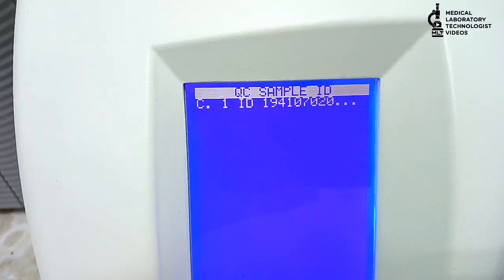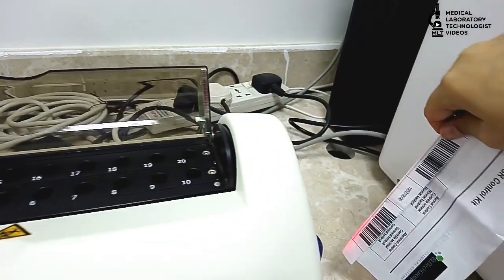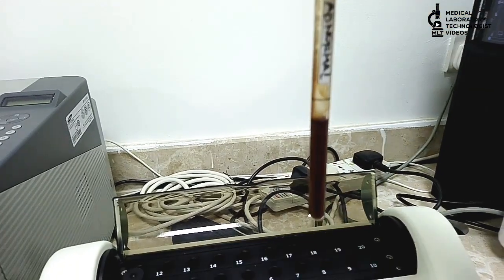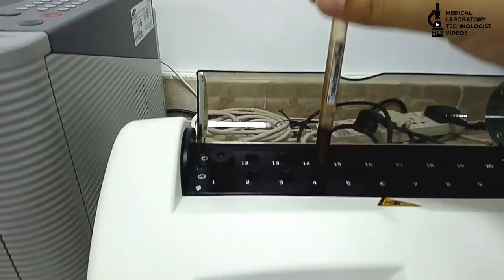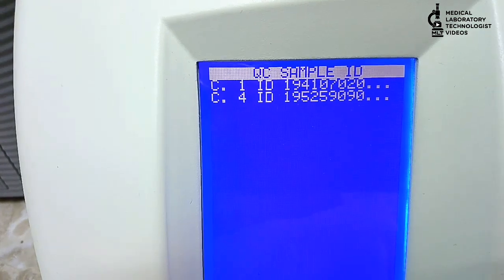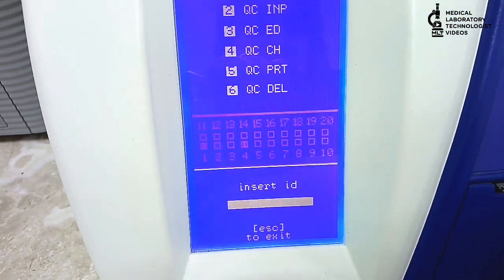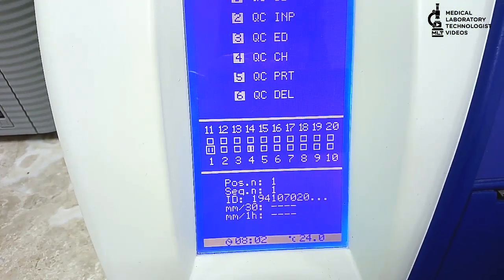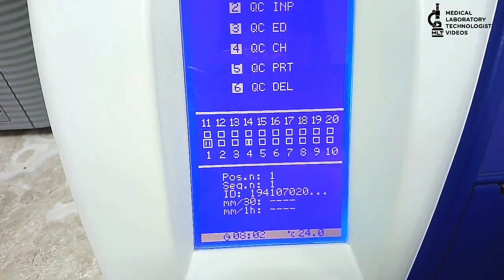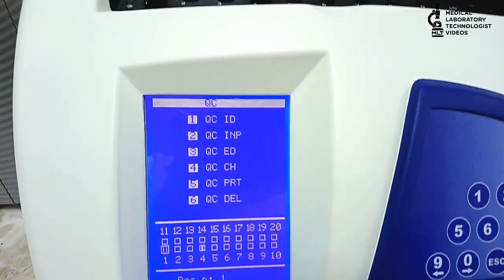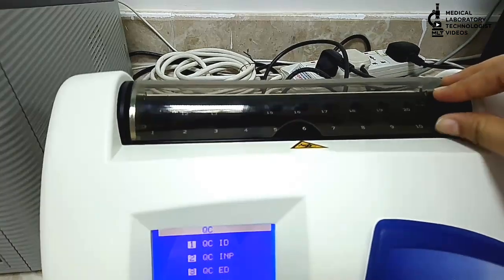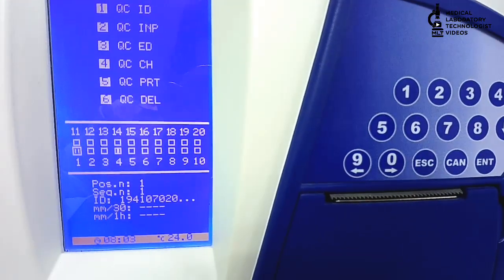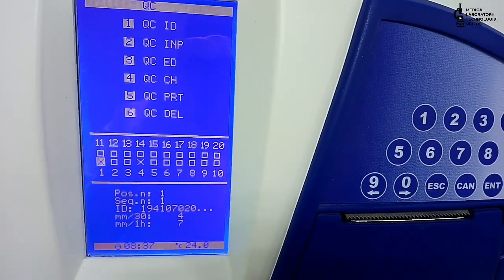Now you see, one position I keep normal control. Now reading barcode for abnormal control, and now I'll keep abnormal control in position 4. So now you see position 1 and position 4, and on the main screen you can see 1 and 4 is showing that sample is inside. We will wait for 30 minutes and we can get our results.